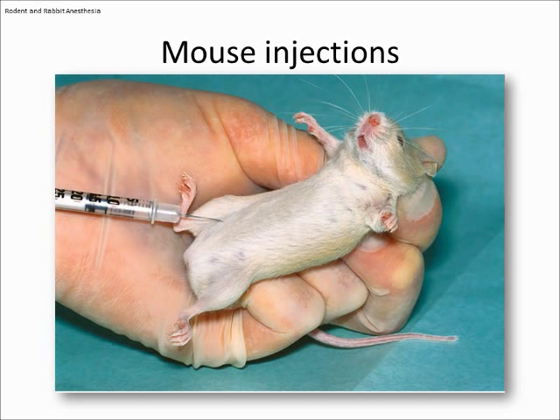So we can actually hold them upside down. Why would I want to hold them upside down if I'm giving him an injection? Okay, that's one. But what's the real reason? Where do you think that needle is? Organs fall down, you got it, baby. So I want the organs as far away from my needle. Nothing is worse than nicking an intestine, nicking a spleen. I nicked a spleen last night during a GDV surgery. It was sitting right up there. You touch a spleen, all a spleen likes to do is spurt blood, like massively. So the whole surgery stops for a couple minutes until you fix that bleeder here.